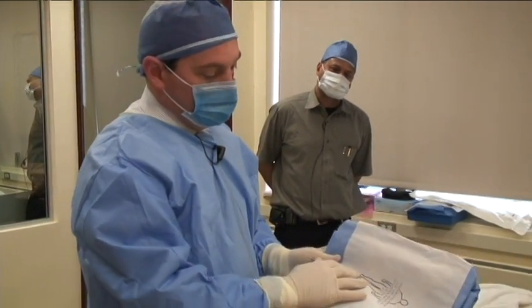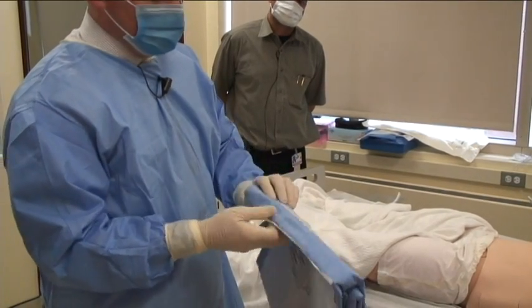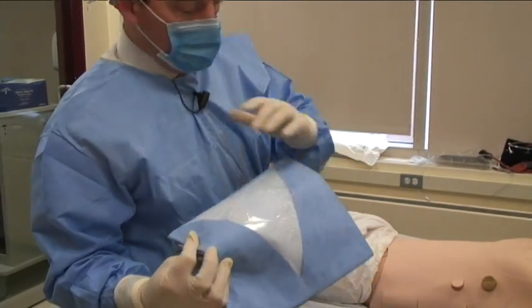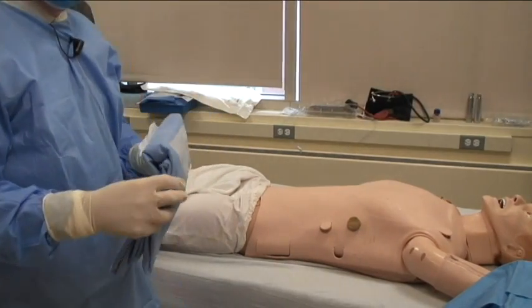Remember, orient head to feet. So this is the head end, and I've removed the one sheet here, and I'm leaving this sheet on. This is for the left-sided placement of the catheter. So this circle is going to be my operating area, and I'm going to put it right around here, around the fourth intercostal space, which is my target in this patient.